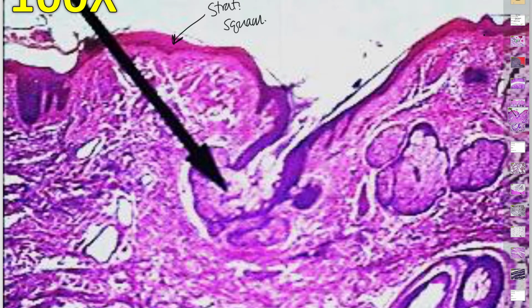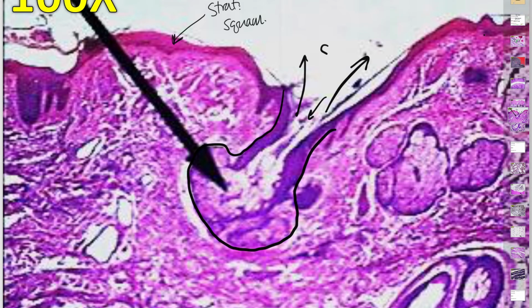This is a sweat gland. And you know it's an exocrine gland because you can see the pore right here, right? This is a pore, and out of that pore, you're going to have sweat in this instance, or you could have oil if it was an oil gland. I just happen to know that it's not an oil gland because if it was, it'd be attached to a hair follicle. You'd see a hair coming up out of it. This, though, is also a sweat gland.